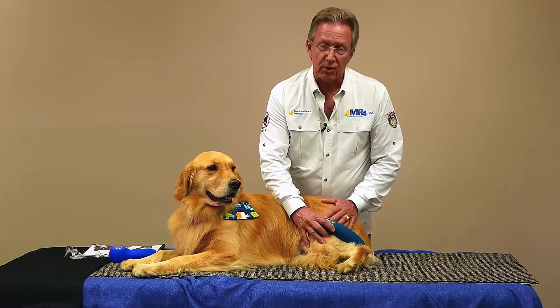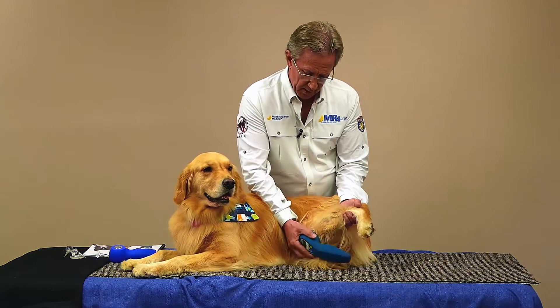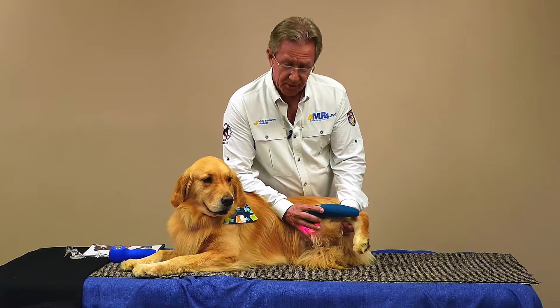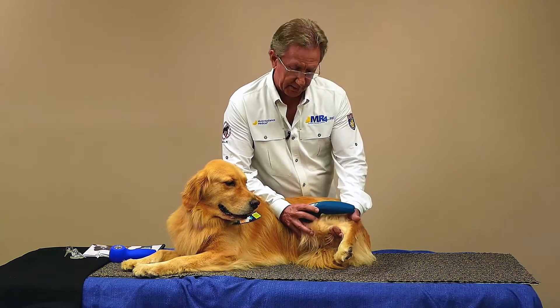Even if there's arthritis only on one side — which is unusual — in all cases we want to treat bilaterally. There will be compensation taking place as they get older, so we want to treat bilaterally always. It's just that simple to work on osteoarthritis with 50 Hertz, gently flexing the joint and treating radially around that joint to get that energy right inside.